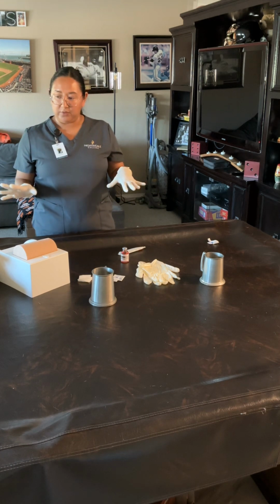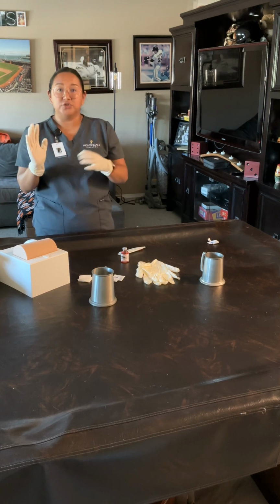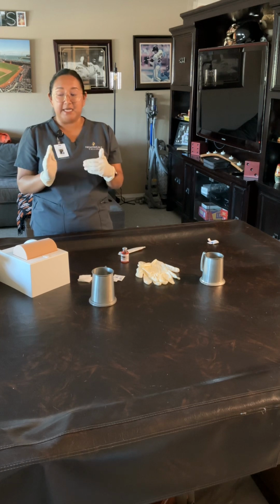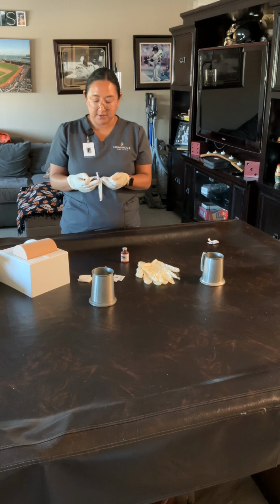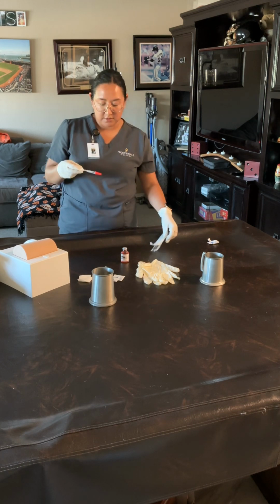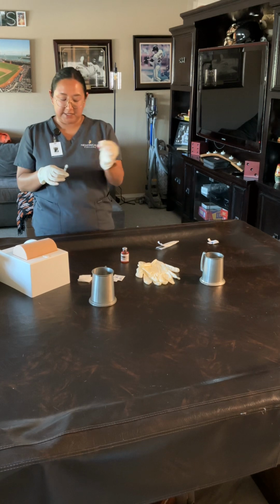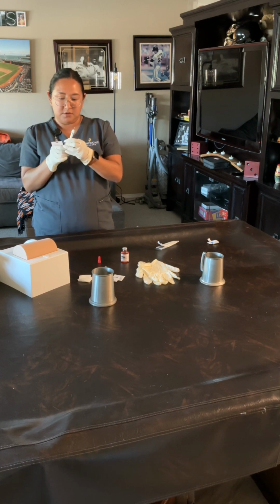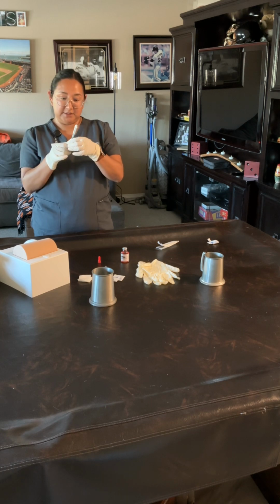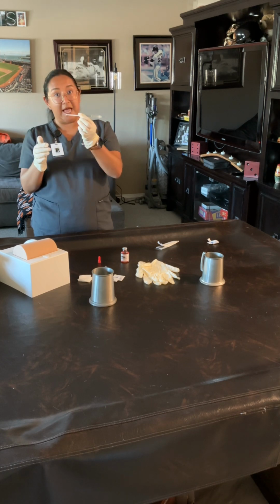And then next I will open up my syringe, which is 25 gauge, 5/8 inch, about 1 milliliter to draw up. So I'll open that up here. Okay, and then I'll take the cap off, and I will draw back about 1 milliliter. There we go. So I have 1 milliliter of air, and clearly it's a 1 milliliter syringe, so I'm all the way at the end.